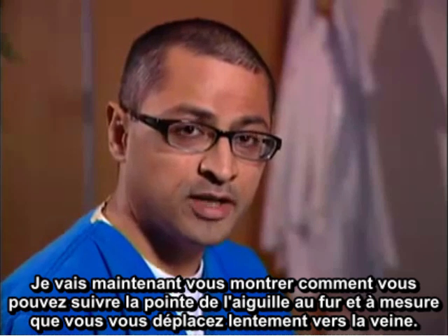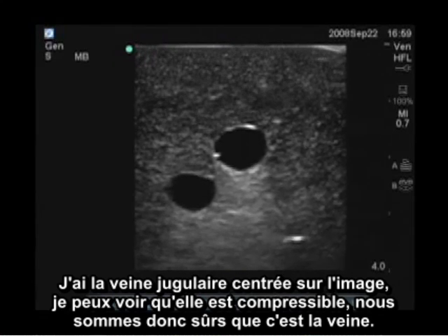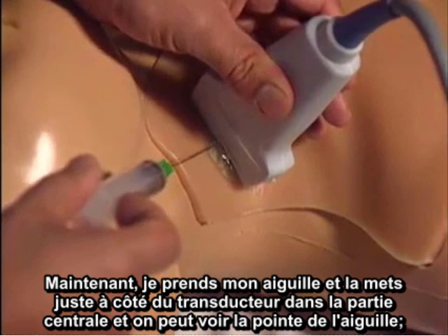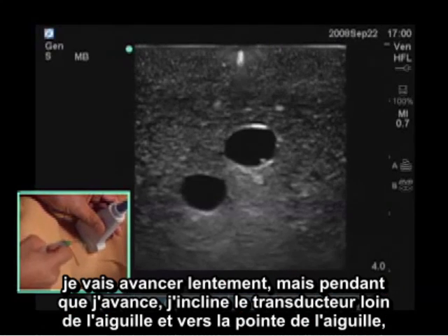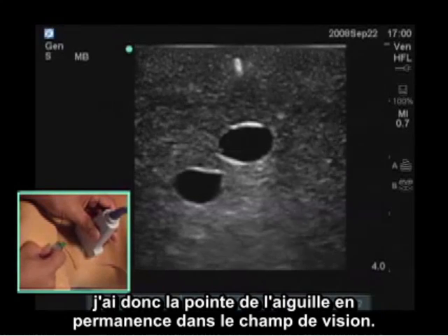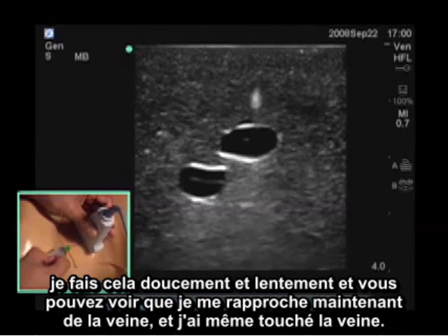I'm now going to show you how you can actually follow the needle tip as you slowly march toward the vein. I have the jugular vein centered in the image. You can see it's compressible. We're sure it's the vein. Now I take my needle and put it right adjacent to the transducer in the mid part, and we can see the needle tip. And I'm going to slowly advance, but while I'm advancing, I'm angling the transducer away from the needle and toward the needle tip. So I always have the needle tip in the field of view. And when I do that, I can always keep track of how far I've gone. And I do this nice and slow.